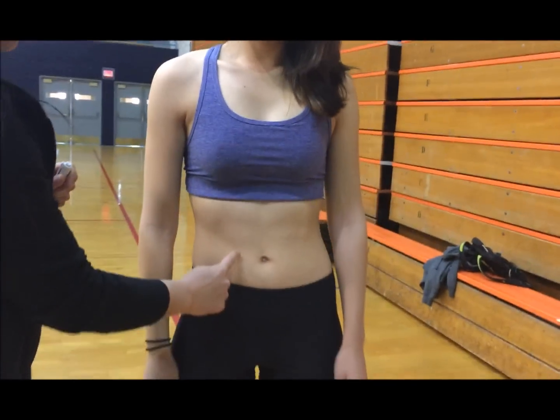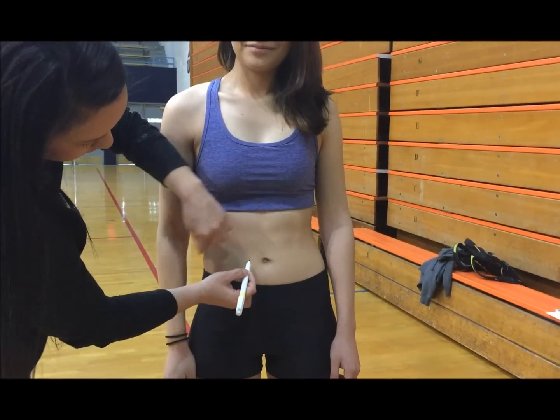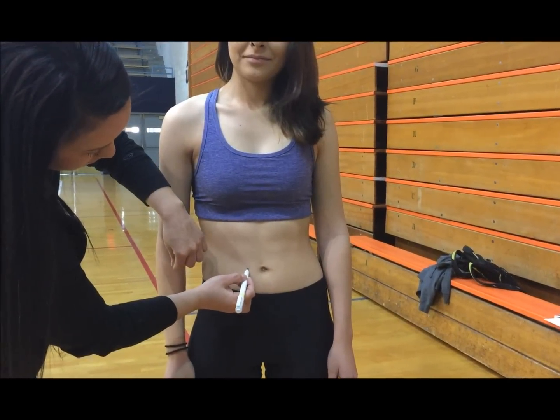Next is the abdominal area, which is two centimeters to the right of the umbilicus, your belly button. This will be a vertical fold.